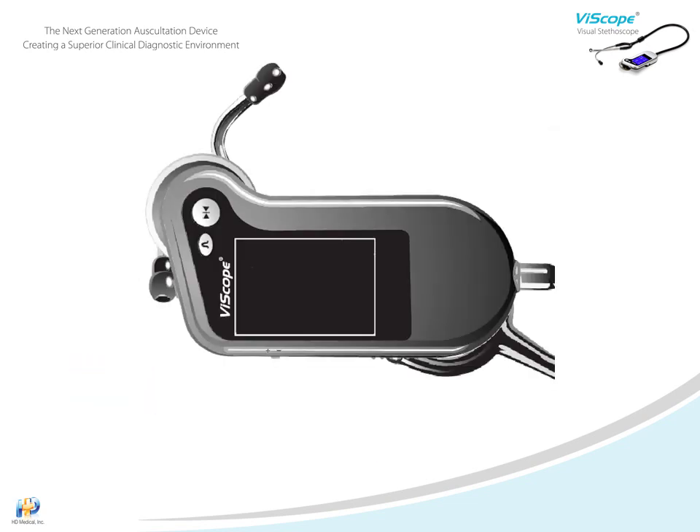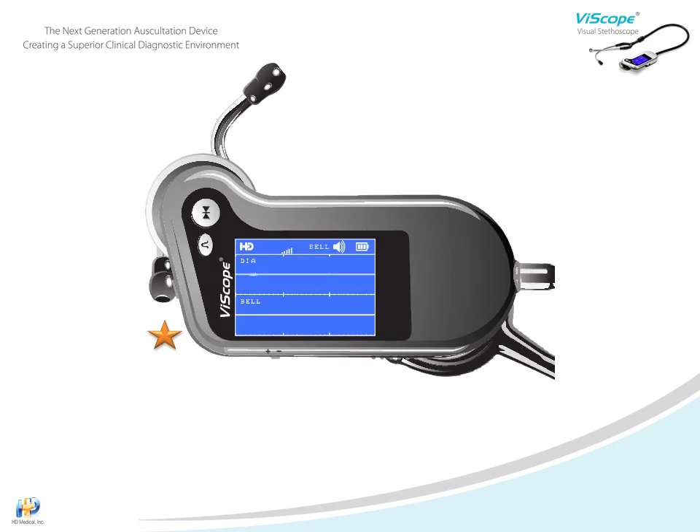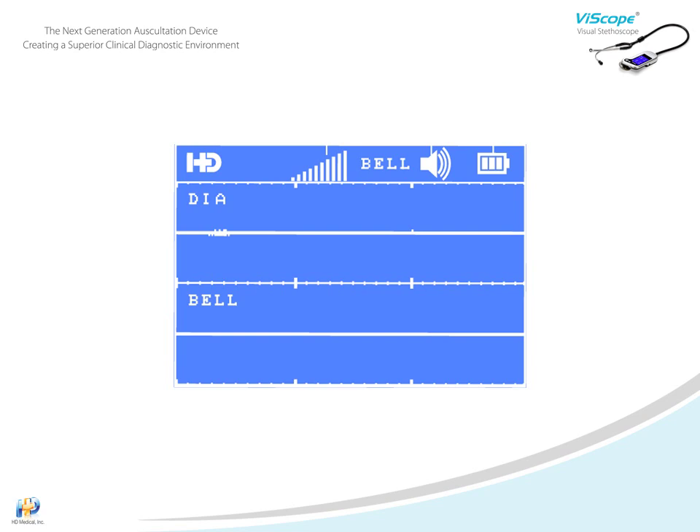The Viascope has been charging for five hours, so we'll turn it on by pressing and holding the power key for three seconds. The LCD displays heart waveforms for quick identification of cardiac conditions. Within this display, the top ribbon is where you will see various symbol and status icons, such as gain level, volume, and battery status. These will change as you invoke different features.